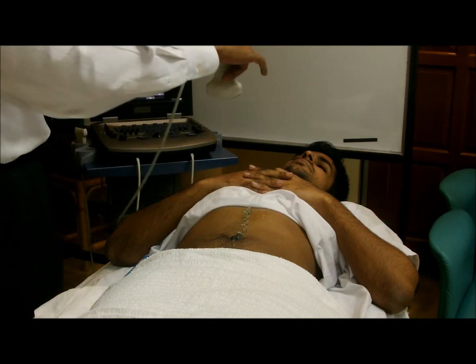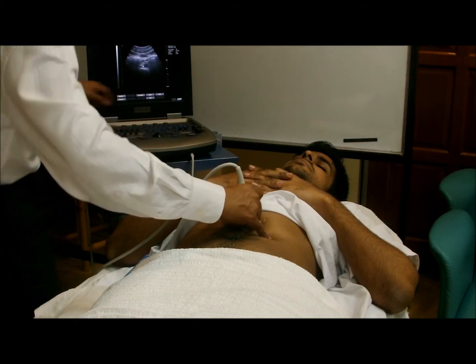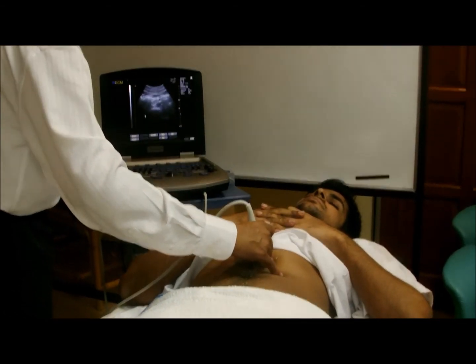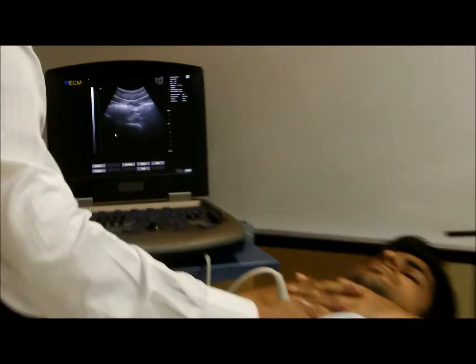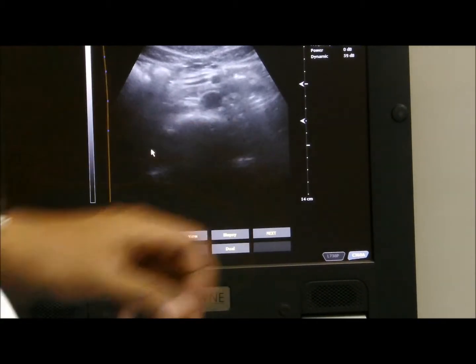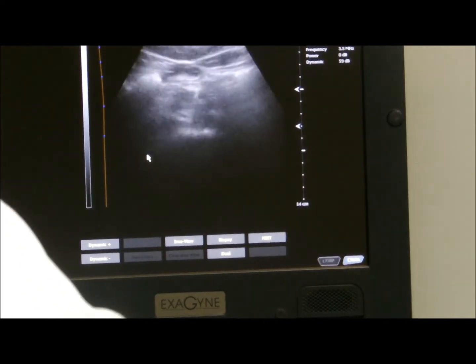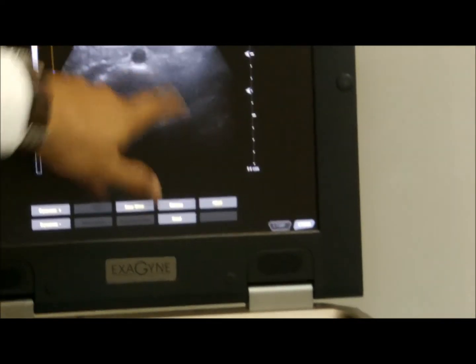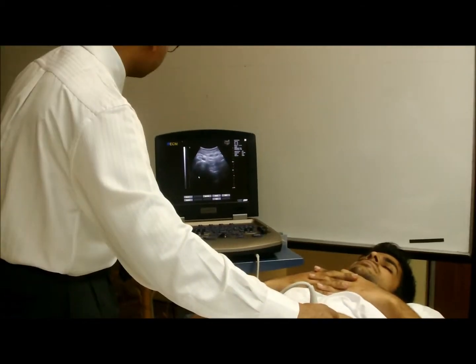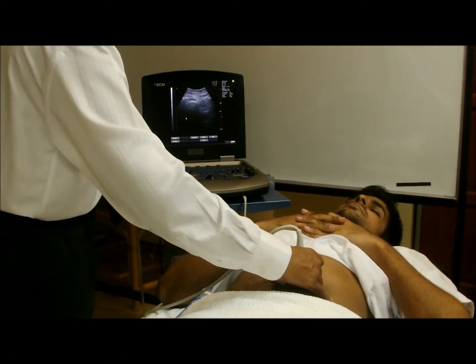So over here, with the arrow towards this side, you just put the probe straight over the epigastric area, and you will straight away see a large shadow here, and that would correlate with the vertebra. Sitting on the vertebra is this coin-like structure, which is pulsatile. That is actually your aorta, and you could run the probe downwards. If you look at that coin, as I'm moving downwards towards the umbilicus, it becomes 2. From 1, it becomes 2. So that is the bifurcation of the aorta.